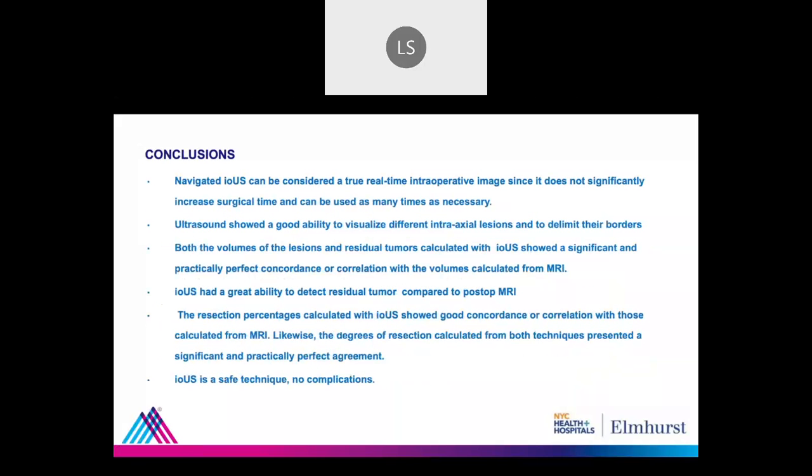And overall, I think that we can conclude, also as a matter of common sense, that ultrasound is fast. It doesn't increase the surgical time in a significant manner. It's a safe technique because it's not related to any complications. The percentage of resection, the visibility grade and the volumes that we calculated are pretty similar to those that we can compare with the MRI.